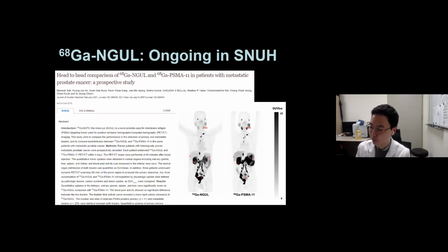And I have another question. In prostate cancer in your practice, you do choline PET first? If there is suspicion of biochemical recurrence, the only available imaging agent right now is the choline PET. So that's our choice right now. So FDG is like the second choice for the PET? Normally, I think the FDG PET is not used widely.